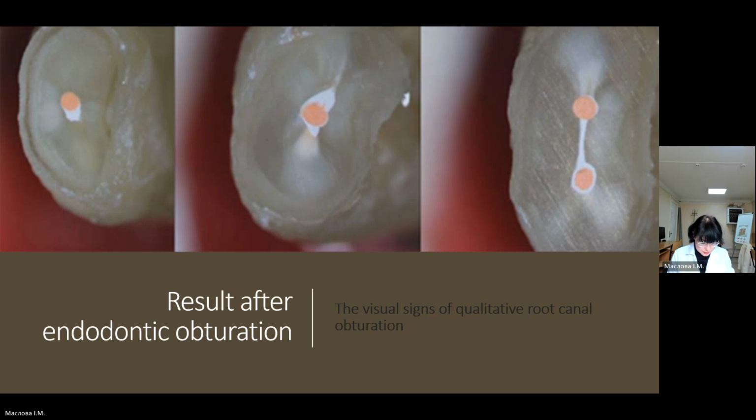In an effort to improve the quality of obturation of the canals came the development of vertical compaction of gutta-percha by using a heated spreader and pluggers or heated obturators to obtain a greater density of root canal obturation materials. Although more homogeneous filling was produced, voids were still present between increments of thermoplasticized gutta-percha.